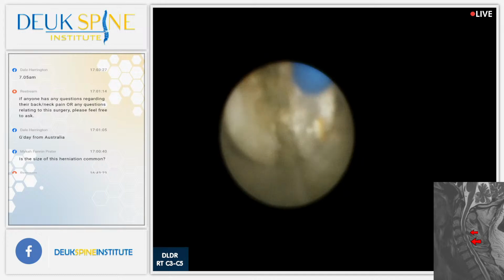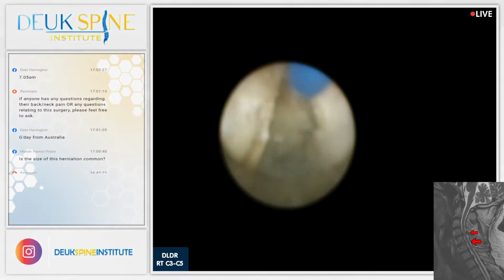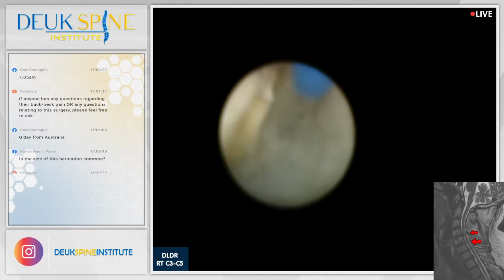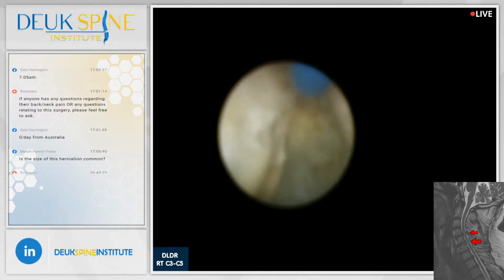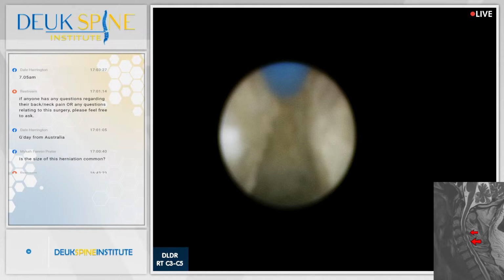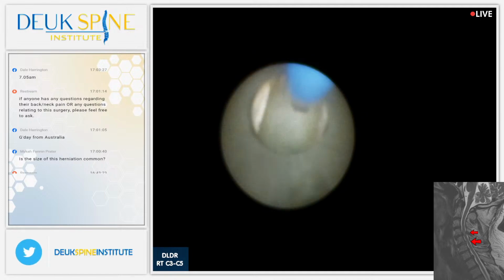This stuff is scar tissue. Now we're not here to get rid of scar tissue. If we were, we'd be here all day, and quite frankly, it just grows back. But we're here to get rid of the herniations. It's actually the herniations that cause the scar tissue. Get rid of the herniation, we get rid of the source of the scar tissue.